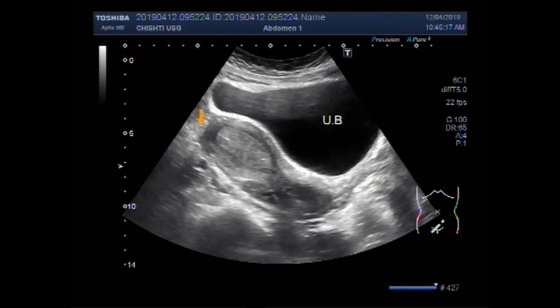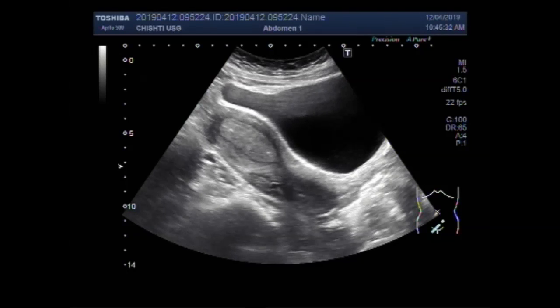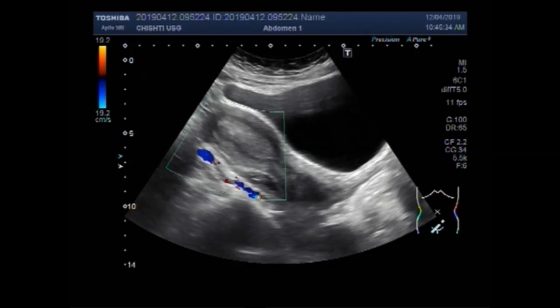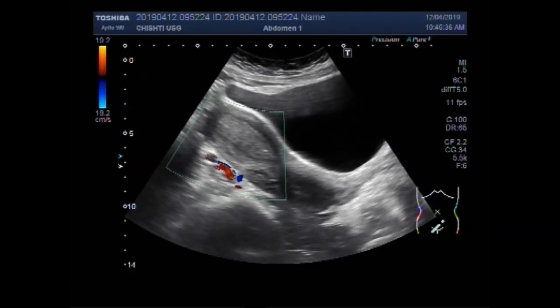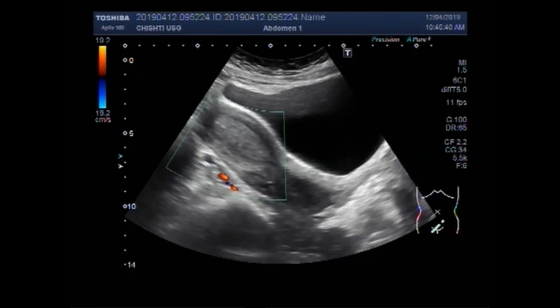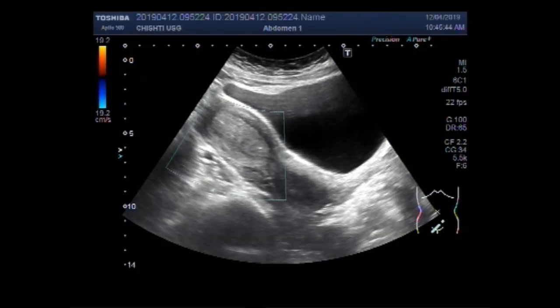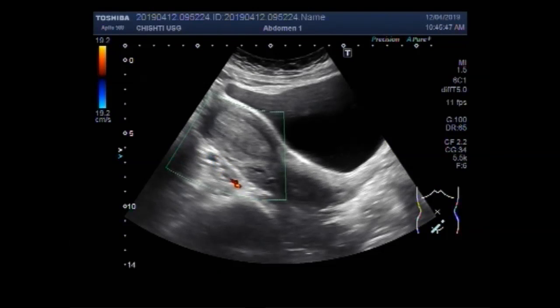This is the urinary bladder, this is the uterus, and this is the polyp. You can see almost no blood flow was seen in the polyp.